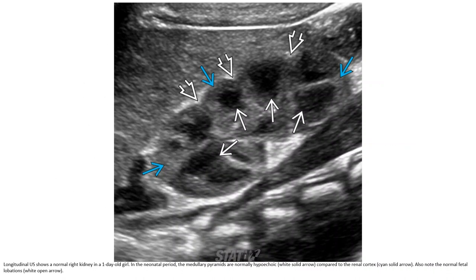This is a normal right kidney in a first-day-old girl. In the neonatal period, the medullary pyramids are normally isoechoic or hypoechoic compared to the renal cortex, representing the normal fetal appearance.